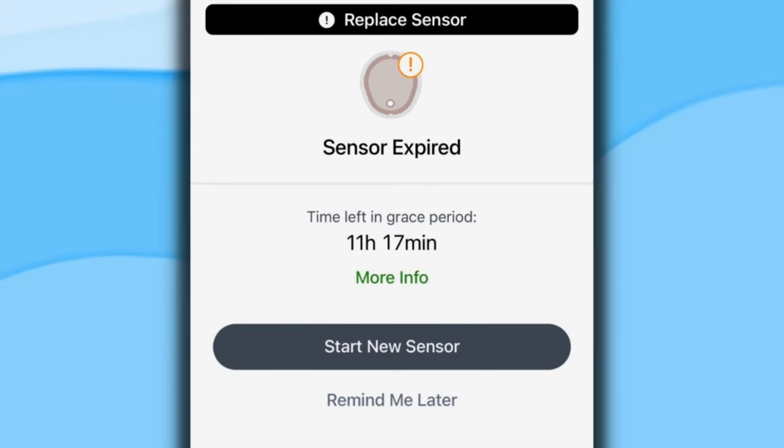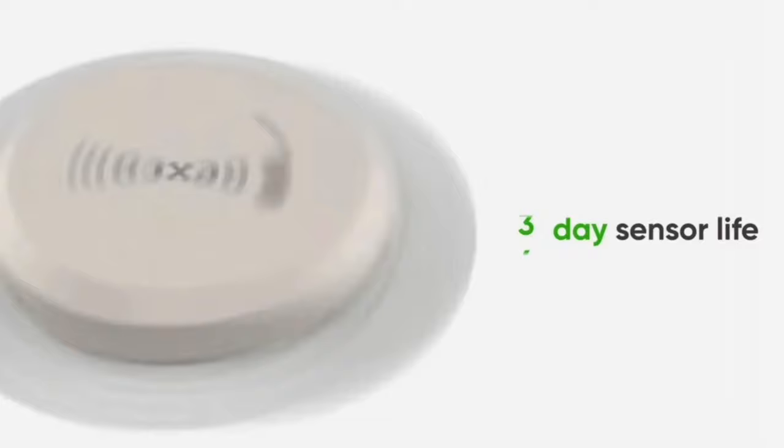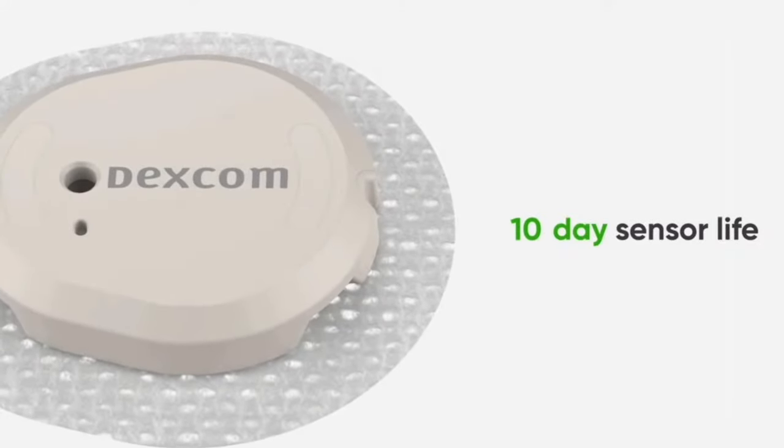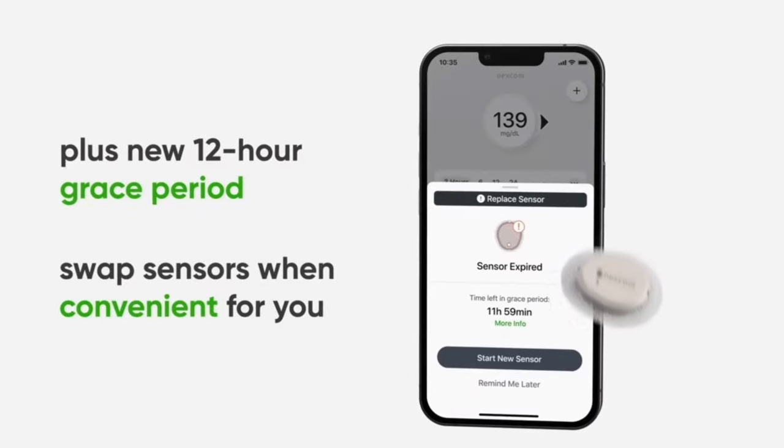On day 10, I was welcomed with a very nice surprise. With the G6, once you hit day 10, your sensor was dead in the water — done. With the G7, it gives you a gentle nudge and says, 'I know you hit 10 days, but I'll give you another 12 hours before you need to change the sensor out.' So you have this 12-hour grace period, which technically makes the new G7 last 10 and a half days — 12 hours longer than the G6.